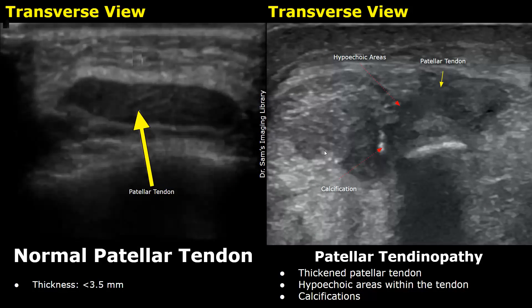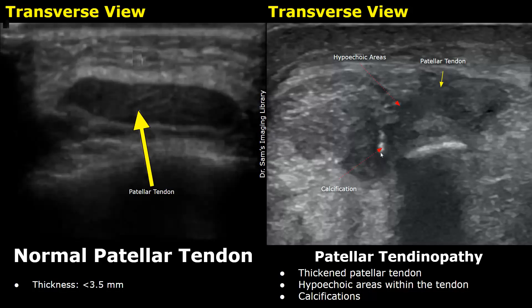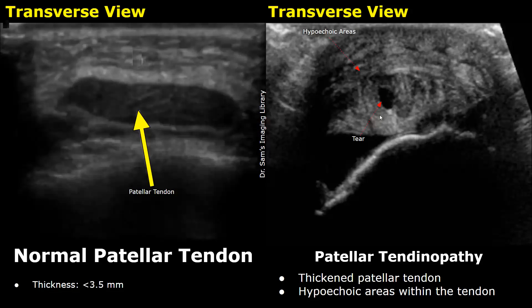This is a transverse image showing the patellar tendon. Here is an image of tendinopathy with a thickened patellar tendon filled with hypoechoic areas, and it even has calcifications. Here is another transverse image of patellar tendinopathy showing a very thickened tendon.